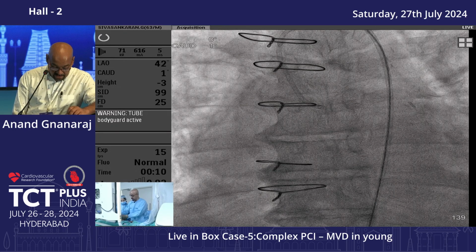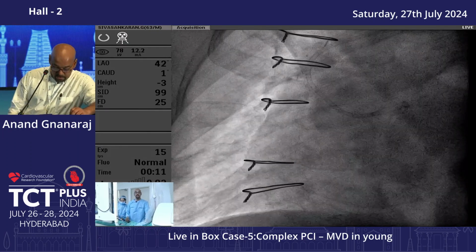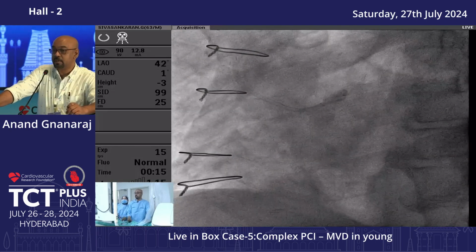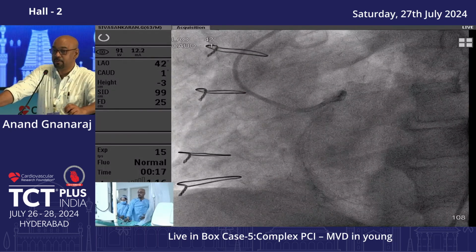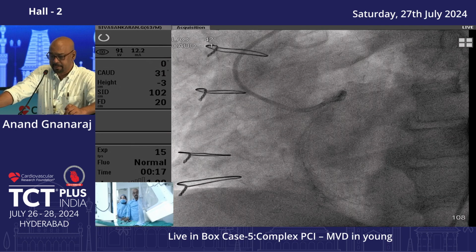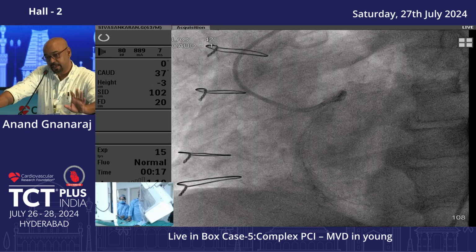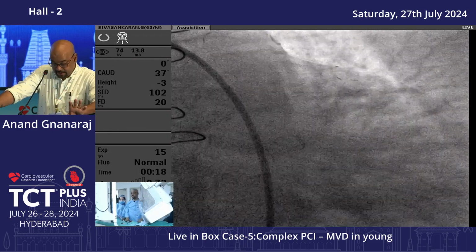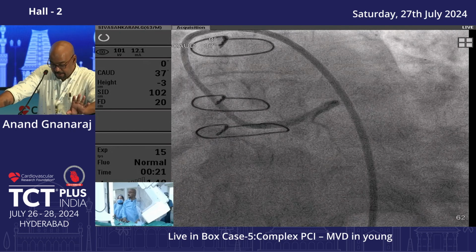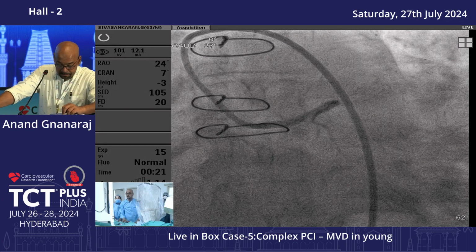This was kind of an unplanned recording. So basically my plan was to initially go retrograde because the channels were very good and antegrade was not very promising. So the basic idea was to go retrograde, quickly finish the RCA procedure and then get out. That was the only idea I had in mind. I had not planned for an antegrade.